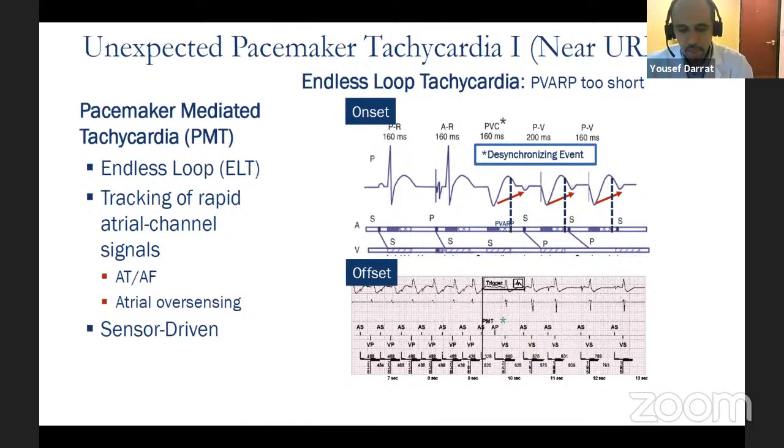Yeah, let me add what the radiologists worry about is heating up, because this is an abandoned lead that has a tip, and the tip may heat up and cause issues. It's like ablating at the tip of the screw there. So that's one issue. But like Mohamed mentioned, there are studies. I think even Mayo Clinic has a study that showed it's generally safe, or the risk of events is low. Let's put it that way.